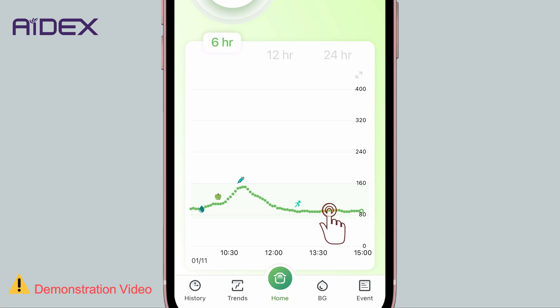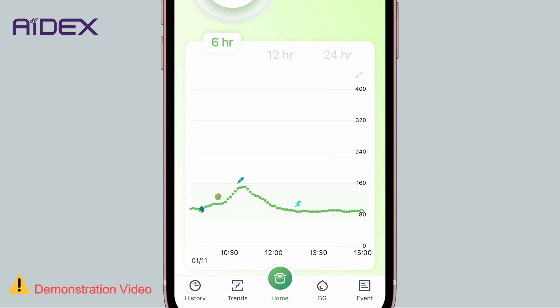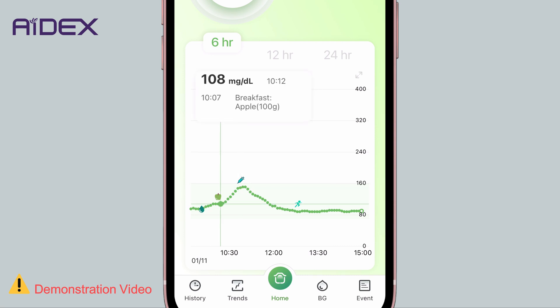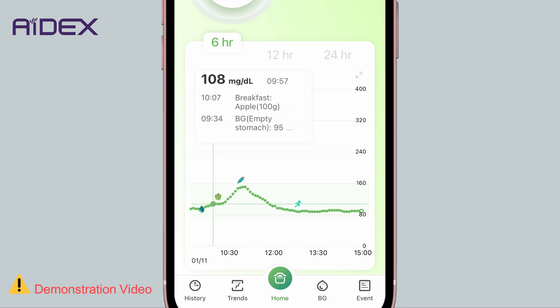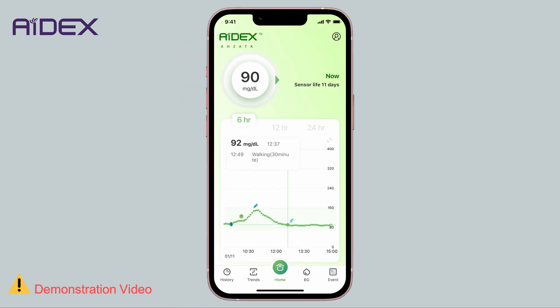If you choose any point on the curve, it will display the date and time of that reading, as well as any other recorded events, such as insulin doses, meals, blood sugar tests, and others. You can also check the remaining sensor lifespan.